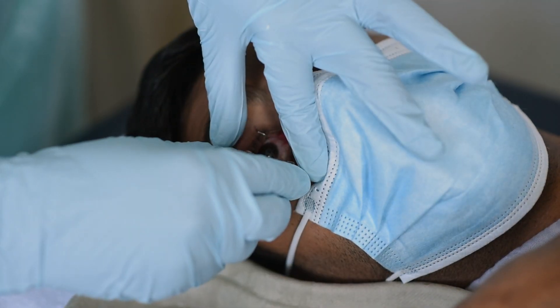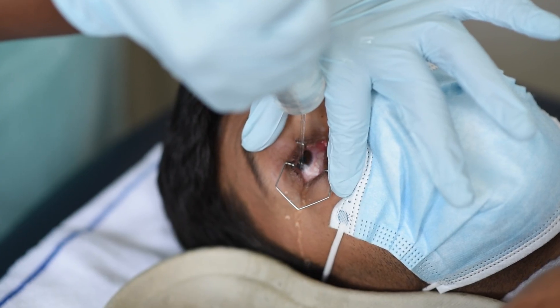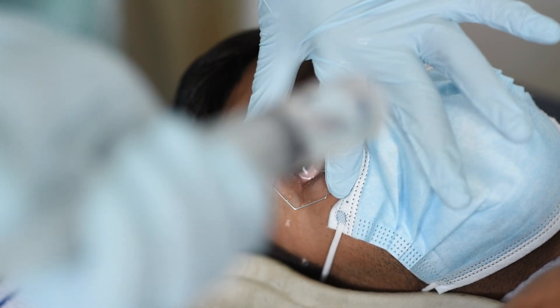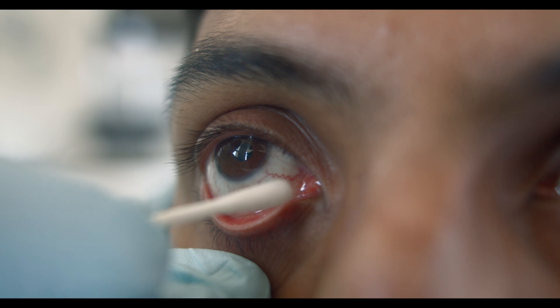Ask the patient to look in different directions. Make sure you irrigate the lower fornix and evert the upper lid to wash away any foreign bodies. If foreign bodies remain, use a cotton bud to remove them until they're all gone.